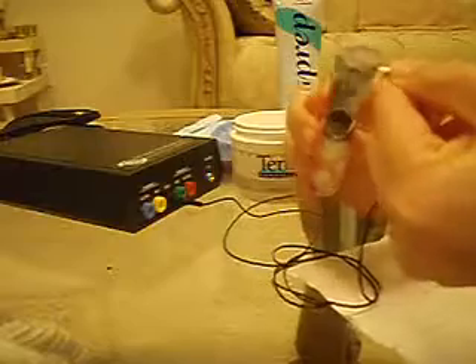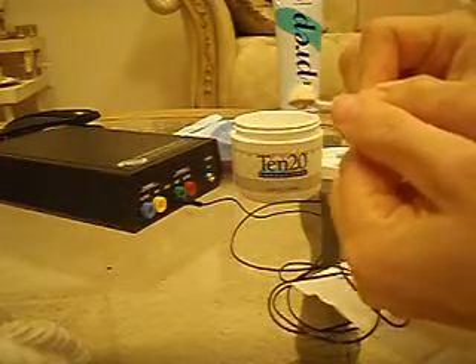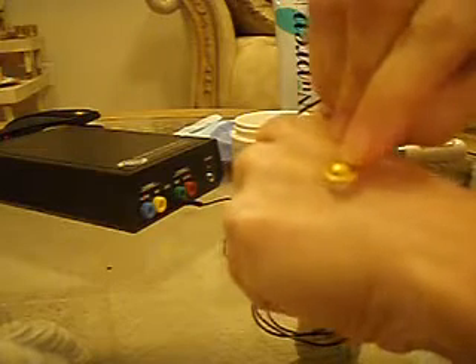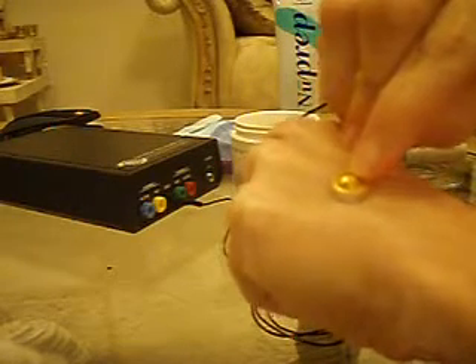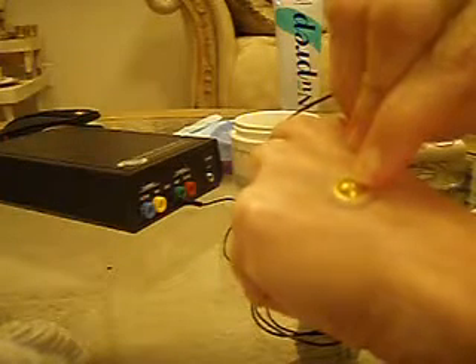To put the electrode paste on, you're going to want to form sort of a cone. It's going to be a little larger than the cup of the electrode. You're going to use about the same size if you have the flat electrode disc as well. When you place the electrode onto the person, you're going to press firmly, slowly, but gently, and it should create a seal onto the person's skin.